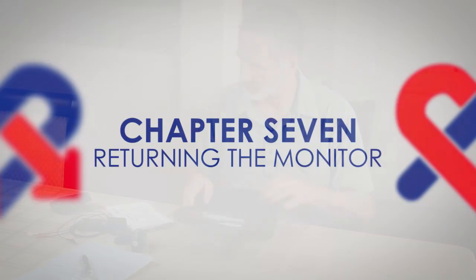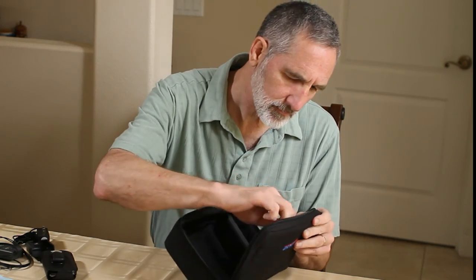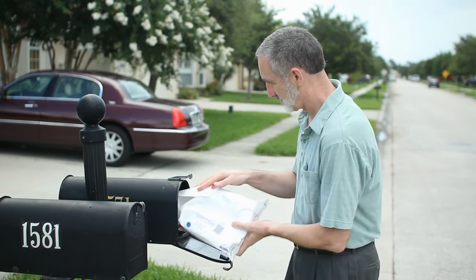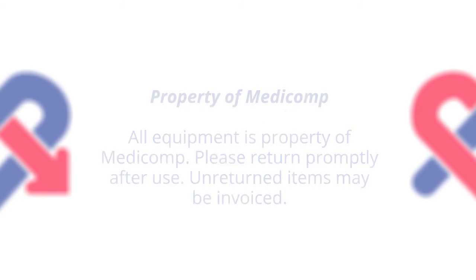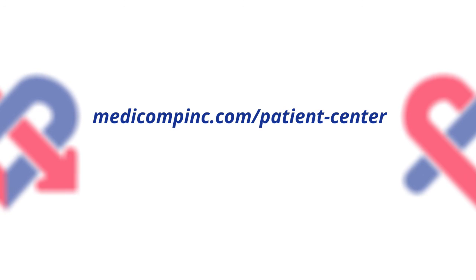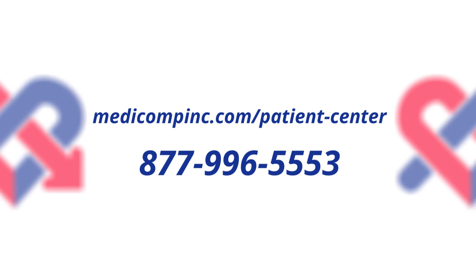Returning the monitor: Once your procedure is complete, please place all components into the monitor kit and place the kit into the prepaid return shipping envelope provided. Place the envelope in any U.S. Postal Service mailbox or hand it to a postal carrier. We're here to help 24 hours a day. Please visit the Patient Center on our website at medicompinc.com/patient-center, or call us toll free at 877-996-5553.